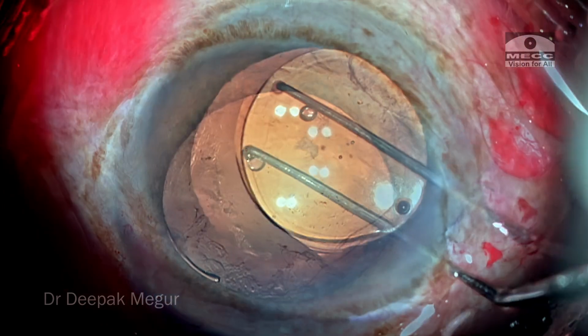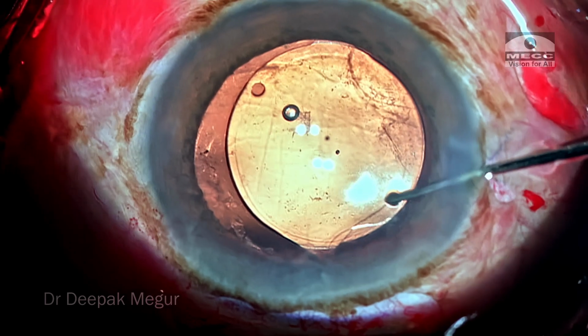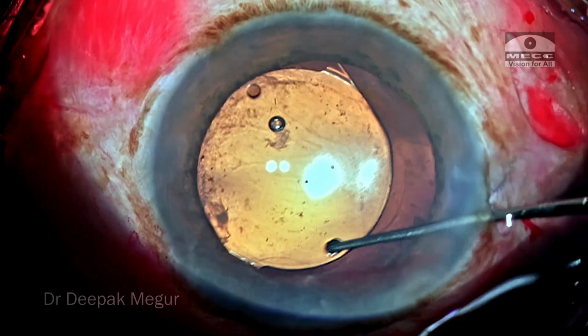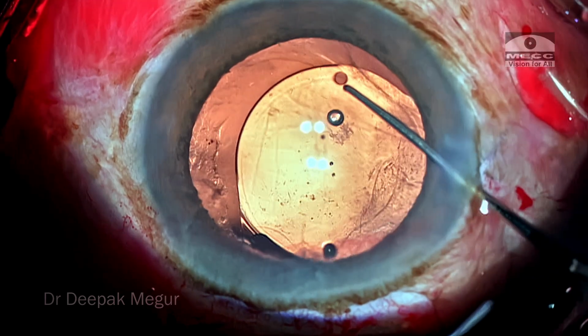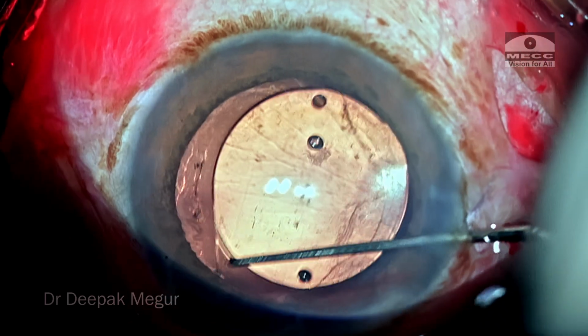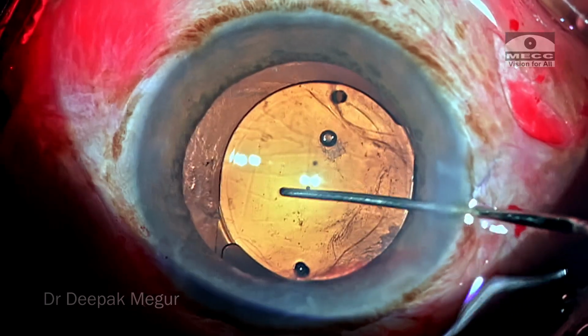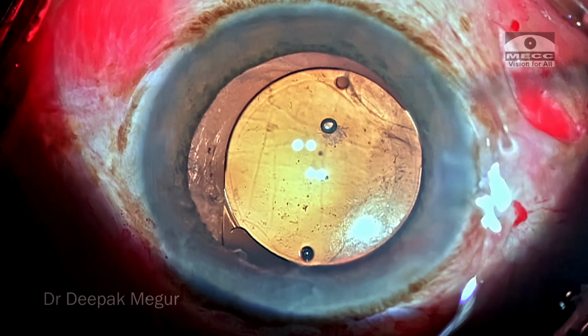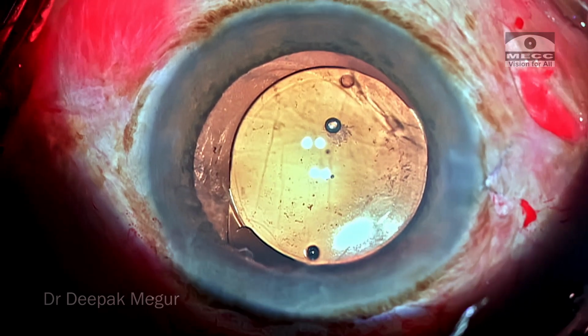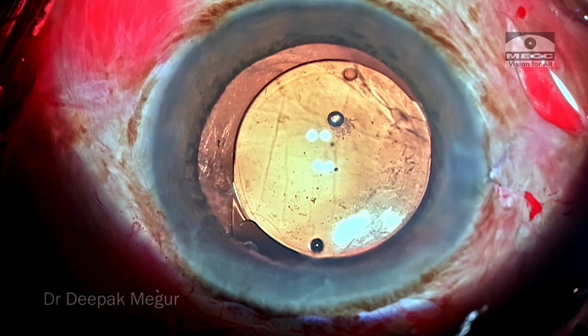Nevertheless, both the distal and the proximal haptics could be maneuvered into the bag, and one good thing is the haptic of the rigid PMMA lens is now in the area of zonular weakness, so it is an additional support to that area. So when the lens was being introduced, I was watching it from the side and I could find that there is something suspicious. So I thought, let me check.